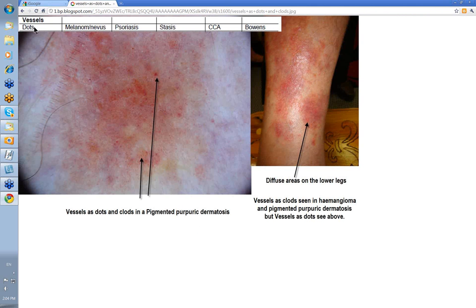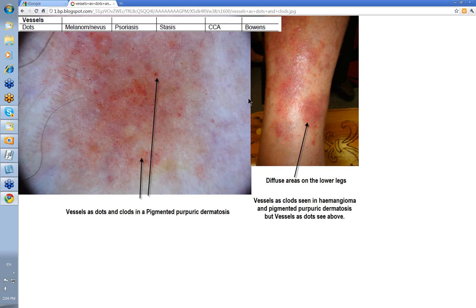We talked before about vessels as dots and vessels as clods. Here you've got a mixture: some vessels as dots but also vessels as clods. This is partly stasis but it's what we call a pigmented purpuric dermatosis. When the redness fades, the iron from the extravasated red blood cells gives a browny or sometimes orange color to the skin. If you stick a dermatoscope on that, you'll see vessels as dots and vessels as clods.